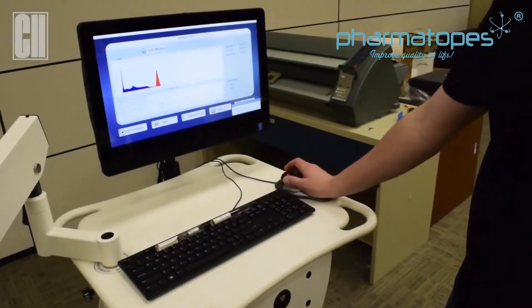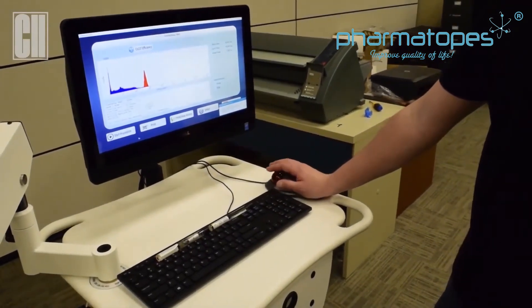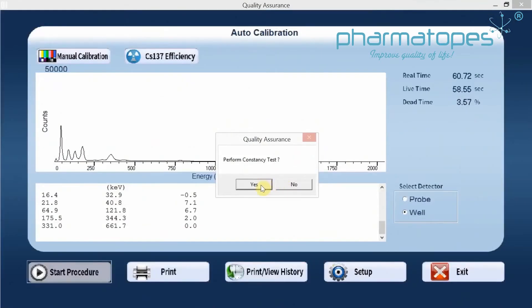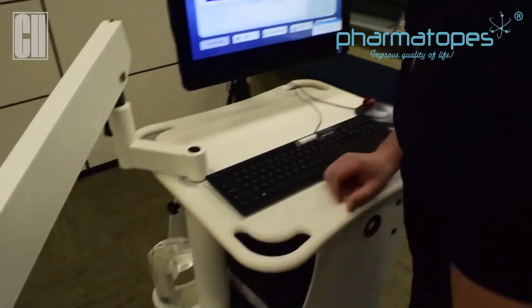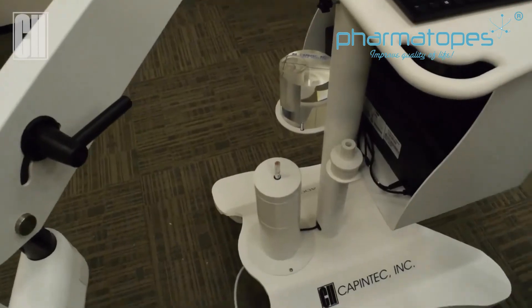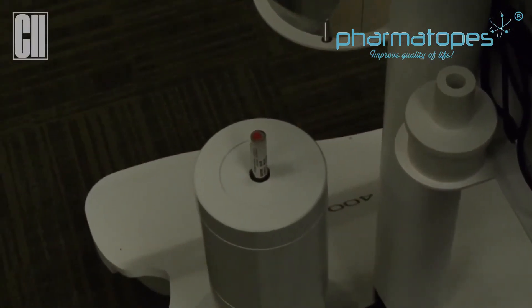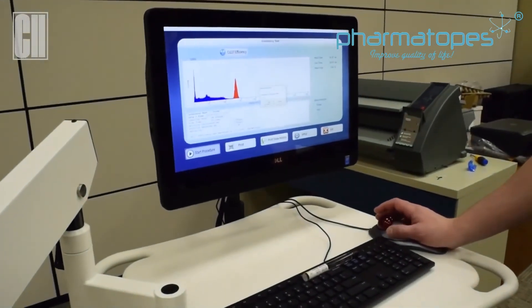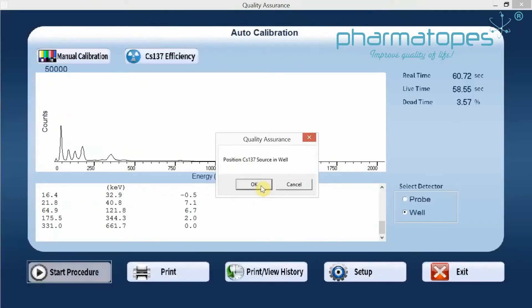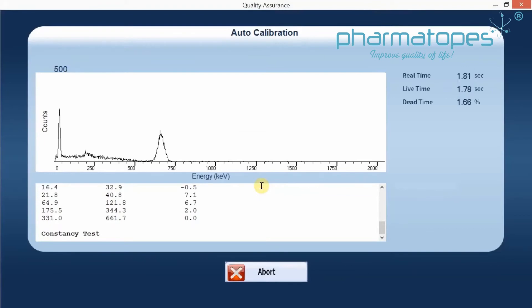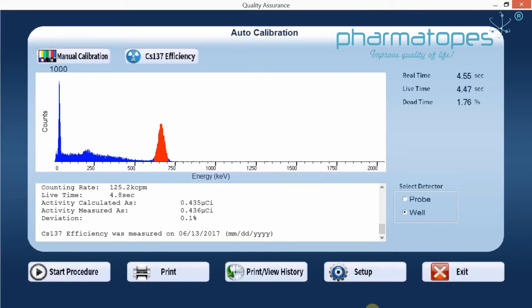Now we check the constancy for the well. Click on Start Procedure and position the cesium in the well. Once that's positioned, click OK and perform the constancy. The result is completed — we're within our plus or minus 5%. We're finished with the constancy check, and you can click on Exit.